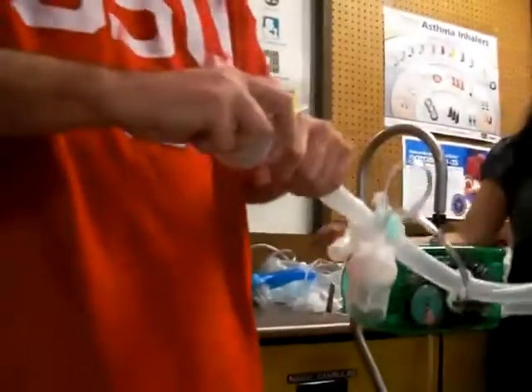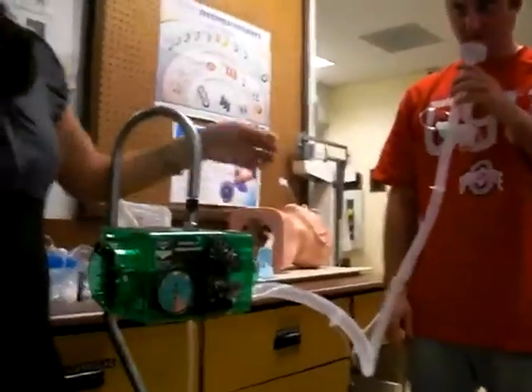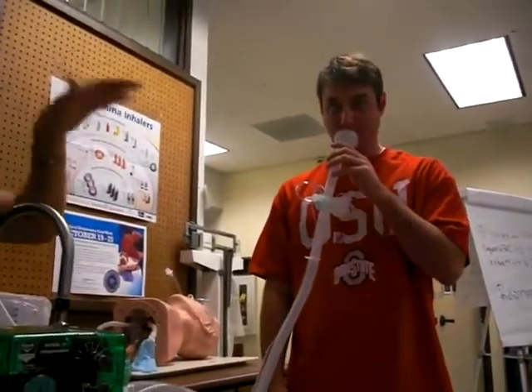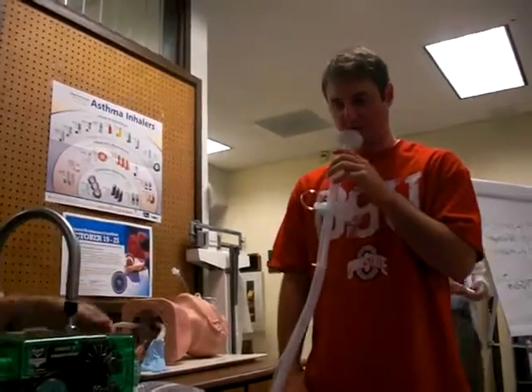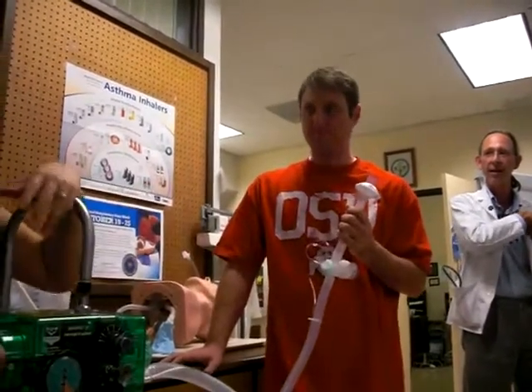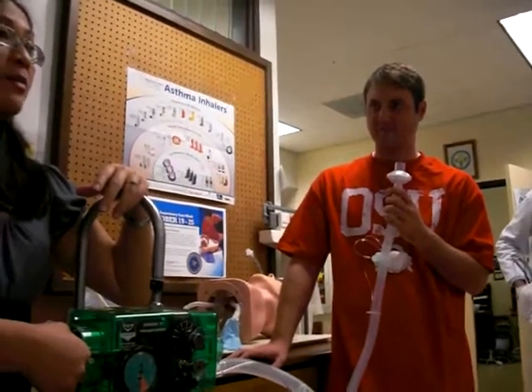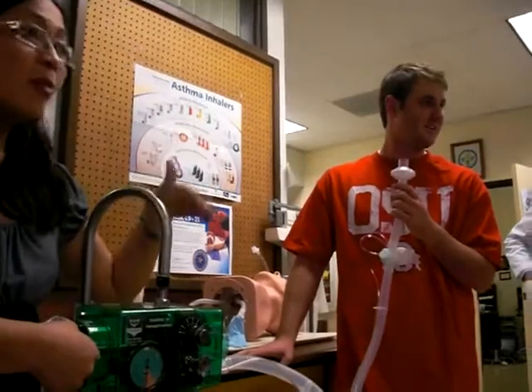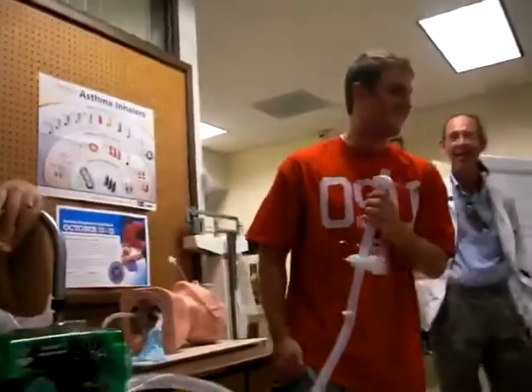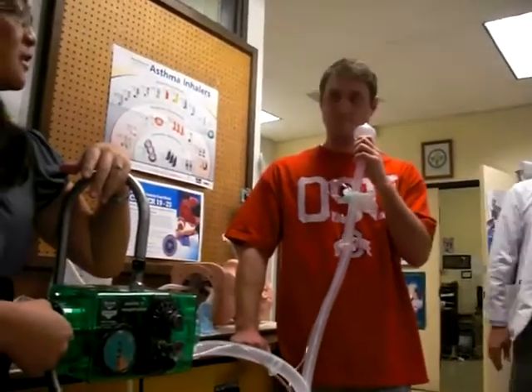You should ask if that thing is clean. These are all brand new. And so what do you tell Bo? You want him, preferably, to be breathing spontaneously — he has to make a good seal. Before you do that, what do you tell the patient when you go in to do this? 'Hi Mr. Pollard, I am Austin from Respiratory. Are you a student? This machine will help you take a deep breath.'